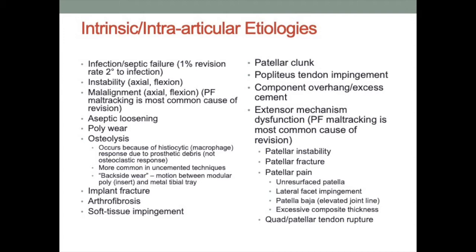Aseptic loosening can be an issue where either the implant debonds from the cement or the cement from the bone. You can have excessive or eccentric polyethylene wear. You can develop osteolysis as a result of the histiocytic response, not osteoclastic. It's more common in uncemented techniques, and you can see backside wear between modular polyethylene inserts and the tibial tray that increases polyethylene wear, leading to this osteolysis. You can have frank failure or fracture of the implant itself.